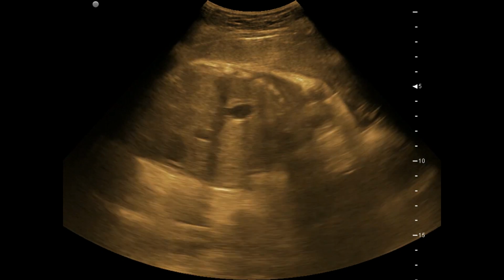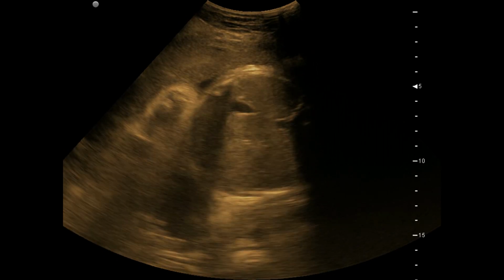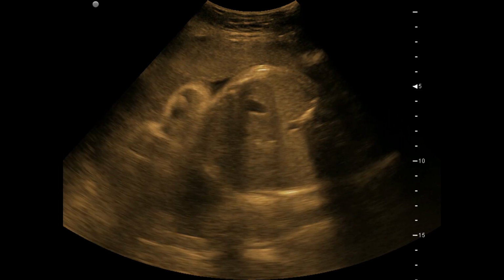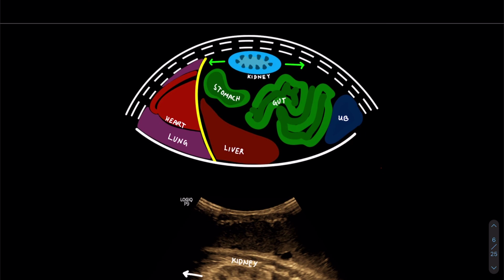Another video of breathing movements on sagittal and axial sections. An alternate observation is the craniocaudal movement of the kidneys. In my practice, I use this more. Fetal kidneys can be easily visualized on sagittal section.